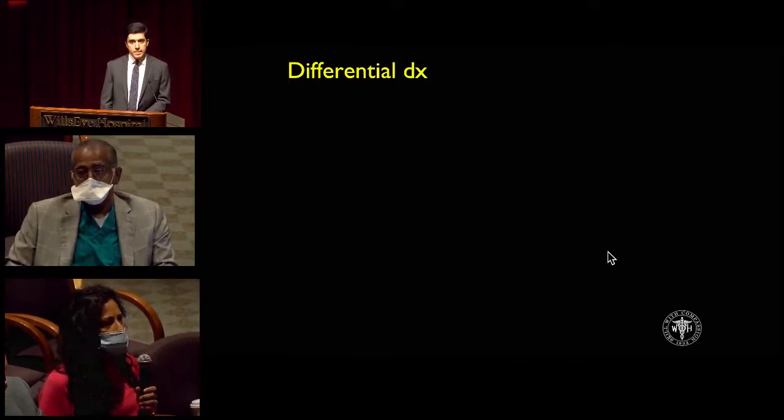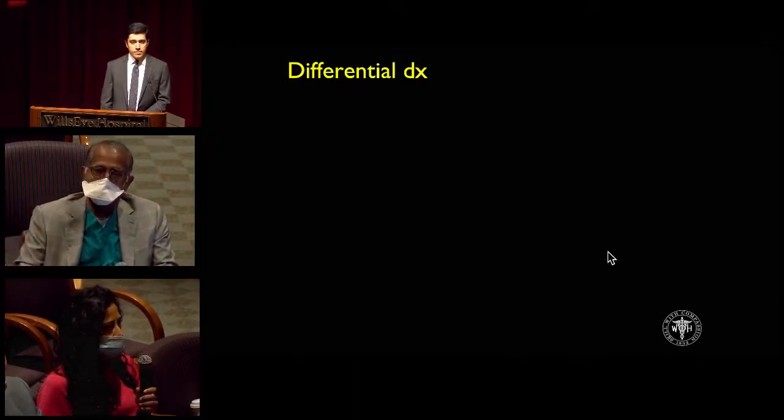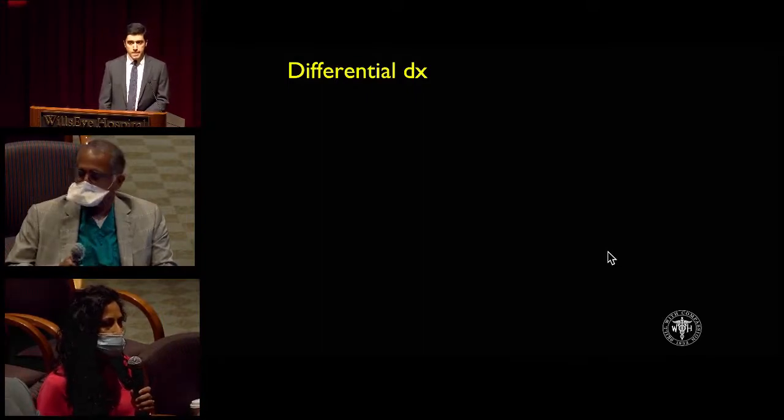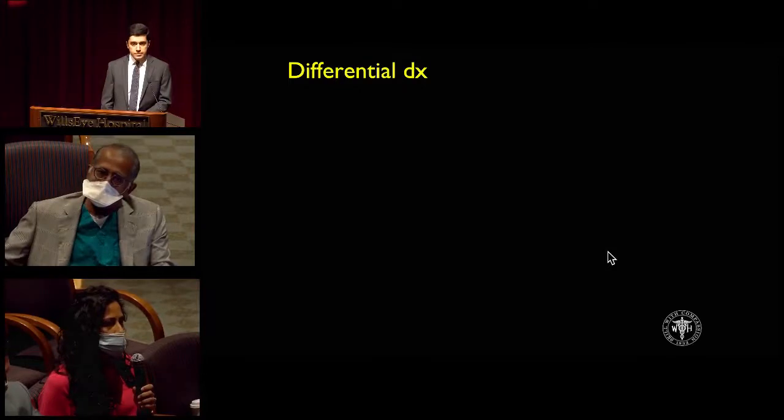You can see a similar picture in things like ocular ischemic syndrome, although you would expect to see more mid-peripheral changes. These were more diffuse, but you definitely can't rule it out based on our imaging findings. But the vessels are usually non-tortuous, dilated. So that's a difference there.